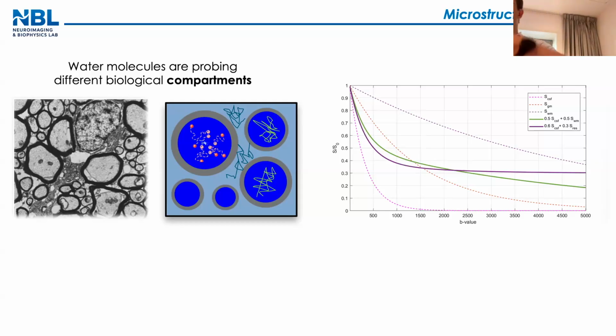When I say multishell, people completely blank and disconnect from my lecture. So now I explain why we need multishell. When we use the tensor and the classical ADC model, we assume essentially that diffusion is a simple Gaussian process. You have water for a certain amount of time, and you can imagine the displacement of the water molecule follows a Gaussian probability, simple.